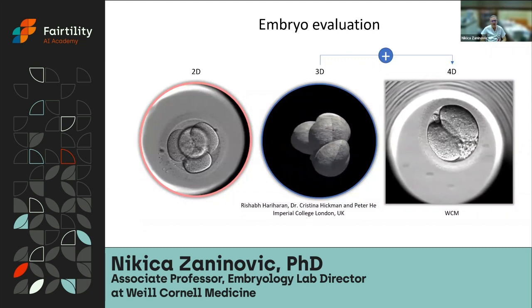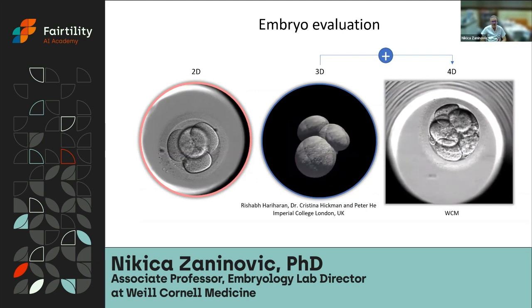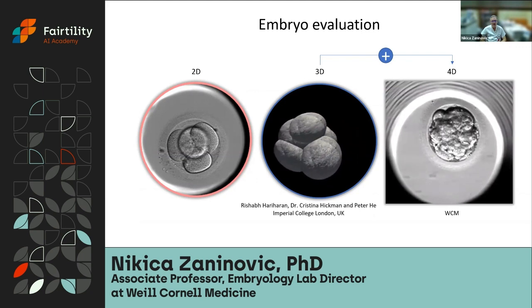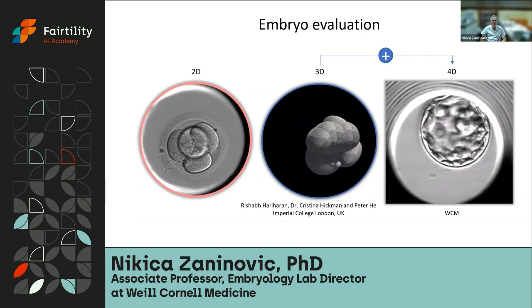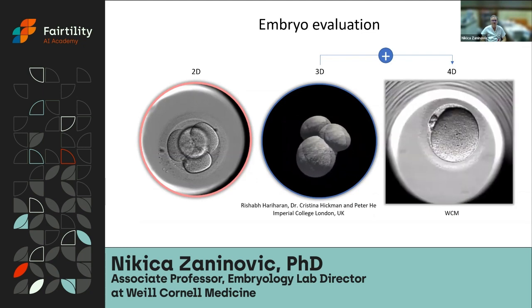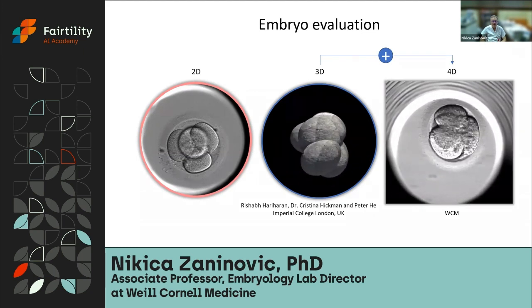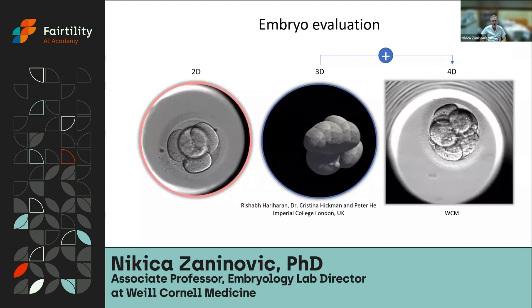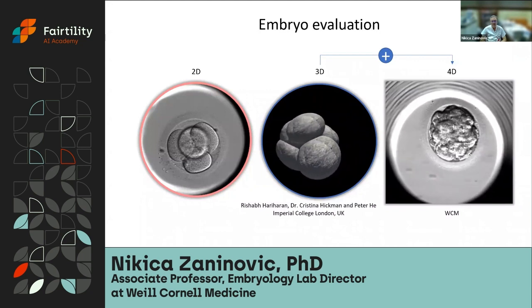We are moving forward in the way we look at embryos, from static or two-dimensional images, to time-lapse, which gives us another dimension, time. But now we can actually create models of cleavage embryos that give us a three-dimensional view. What is the organization of each of the blastomeres within the embryo? If we can combine 3D and 4D together, it can give us new knowledge about how the blastomeres are oriented and organized, and how the embryo itself is developing.